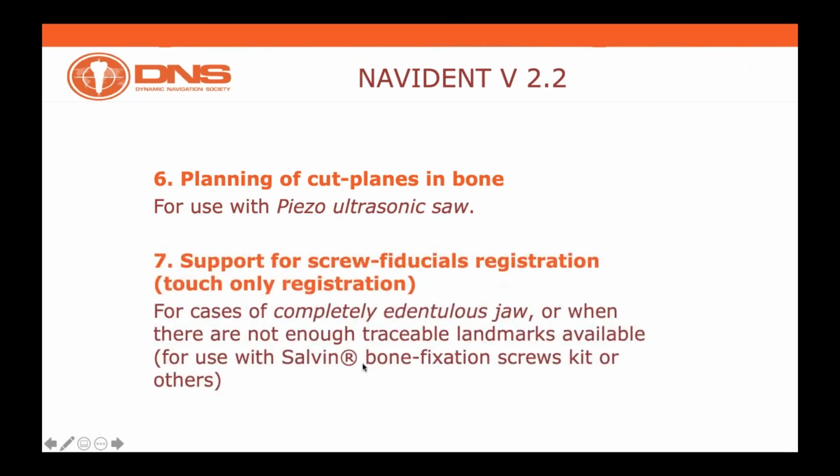Then we will present a protocol which is geared to completely edentulous jaws, a protocol which enables us to overcome the existing protocol, which is using a mini implant placed before surgery. We've been talking about it, and we already discussed that placing a mini implant before taking a CBCT might have represented some challenges.